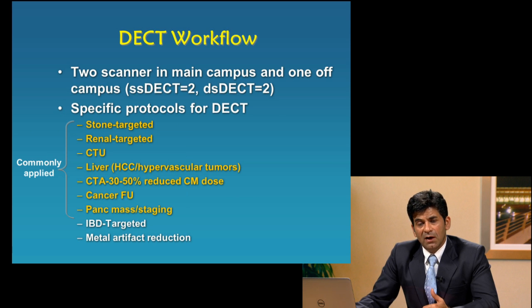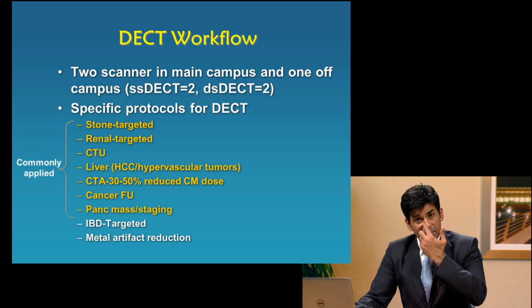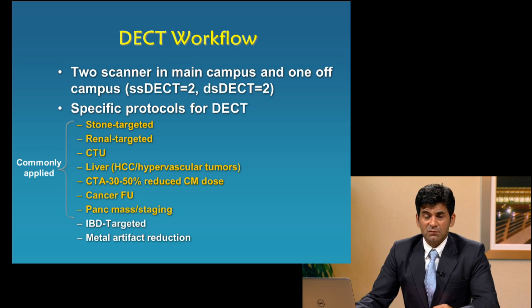To make this workflow easier in our practice that has 4 dual energy CT scanners, and we are likely to have more of these scanners, we created disease-specific protocols. Some of these I have listed here, but it basically falls into those 4 categories that I mentioned earlier.